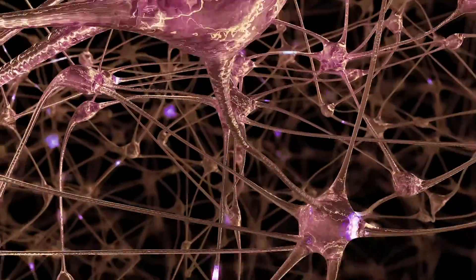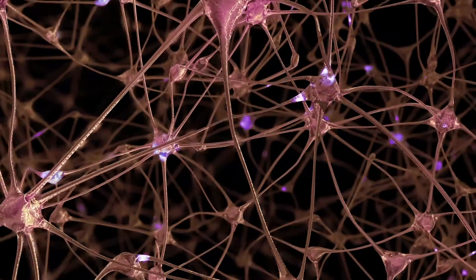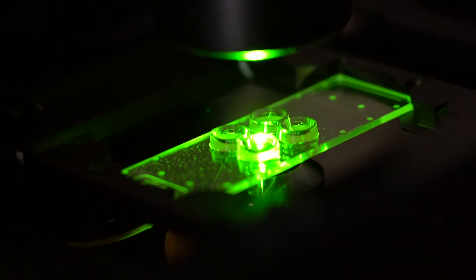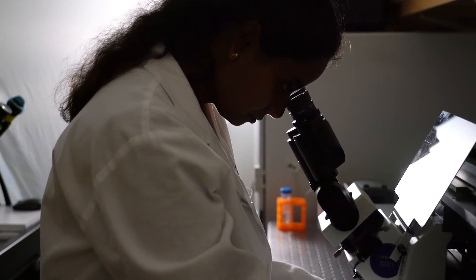Neurons are extremely polarized cells, extending axons and dendrites long distances to form connections with other cells. Zona provides easy-to-use culturing platforms to study these neurons in their unique polarized form.